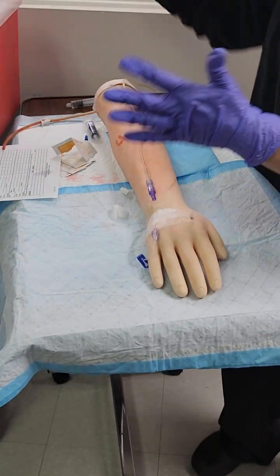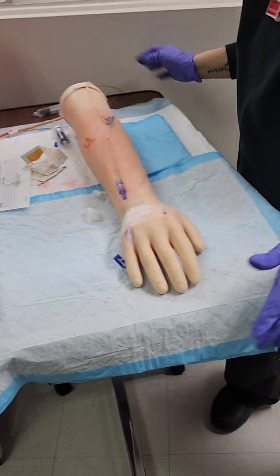You'll have this, and then this will be separate.